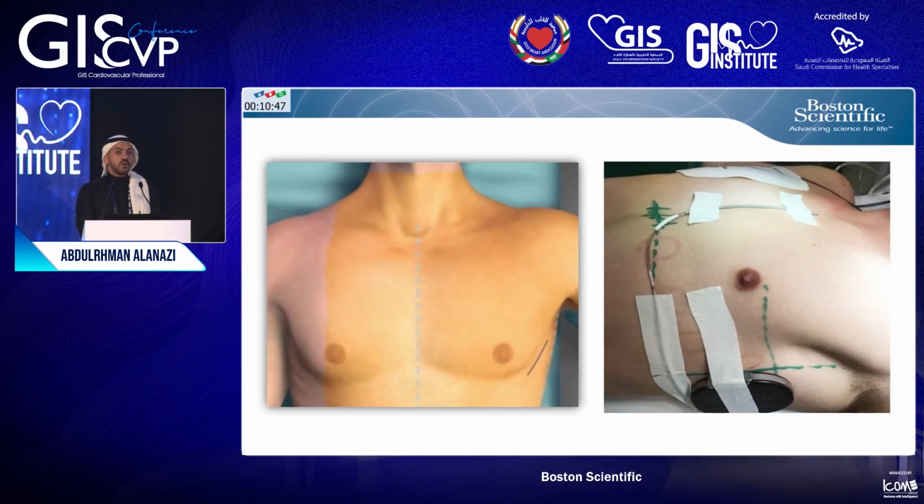Therefore, we come to a point that when we are screening the patient, people usually do it in a way that they are just screening the left sternal margin. But we need to screen the patient in the three positions to see the optimal signals. The patient might pass in the left sternal margin, but still have better signals on the right sternal margin or in the median. So the screening needs to be done for all three positions.